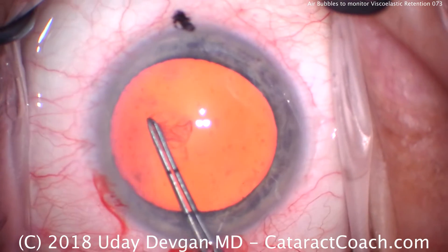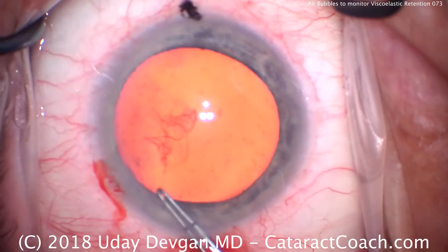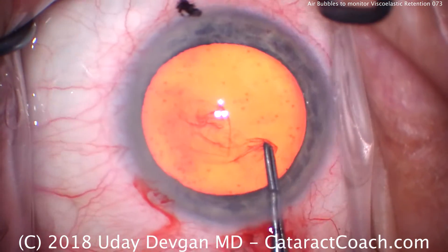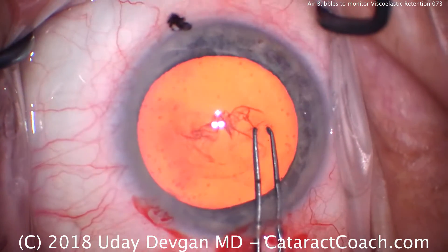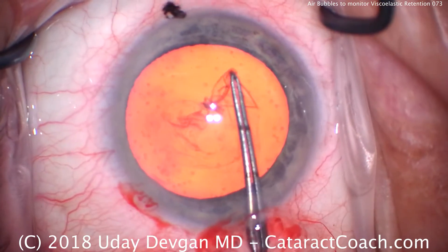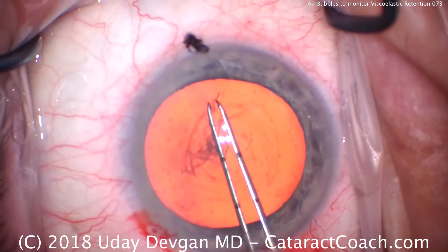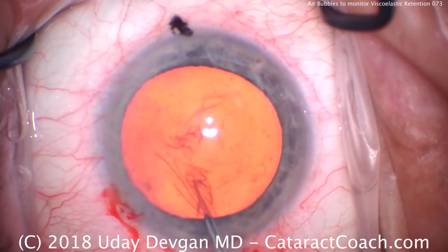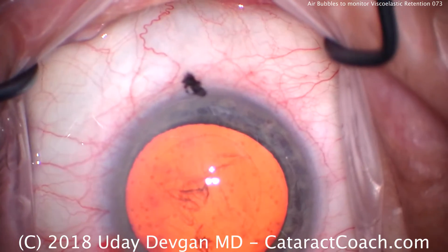So we'll make our round capsulorhexis. Because of the focus plane, we're focusing down on the capsule, but we can still tell that there are bubbles up against the corneal endothelium, depending on the angle and the reflection of light. You'll note that I center the capsulorhexis on the visual axis, which is why it's a little closer to the nasal edge of the iris.